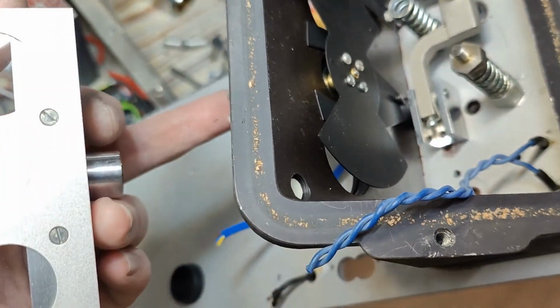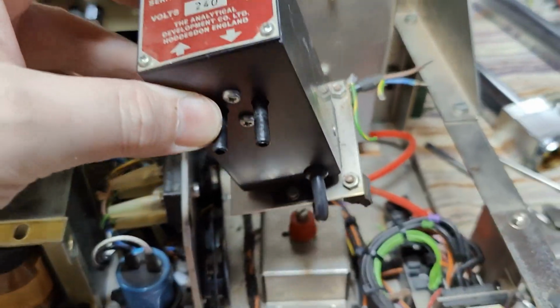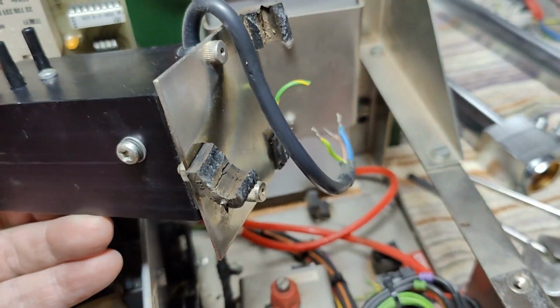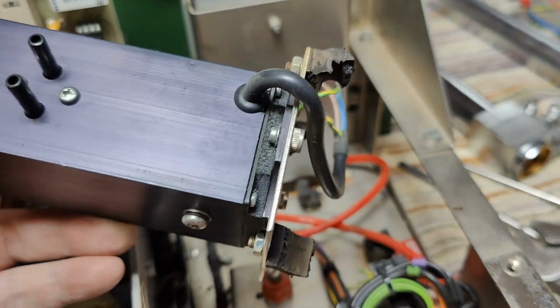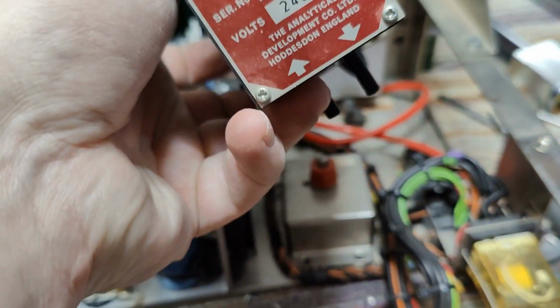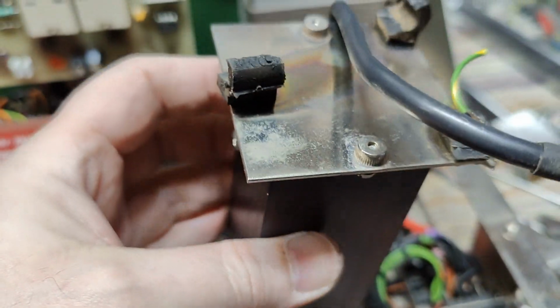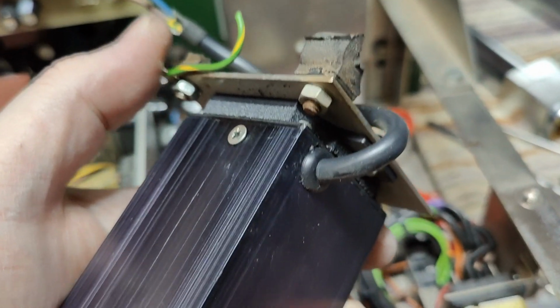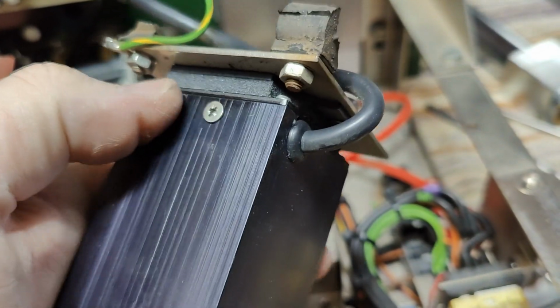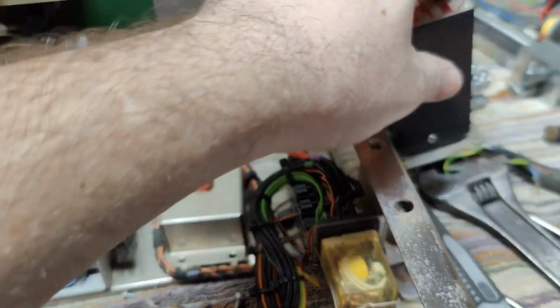Yeah. Well. Turns out the pumps here are of course mounted in this nice flexible rubber. As you can see, it's completely dissolved, and so that makes it easy to take these out. It's a 240 volt pump, and it doesn't really say a lot here about what this pump can do, so I'll have to test if they do anything. And there's one more little soft rubber mounting here on the bottom as well, so now they just made it doubly good.